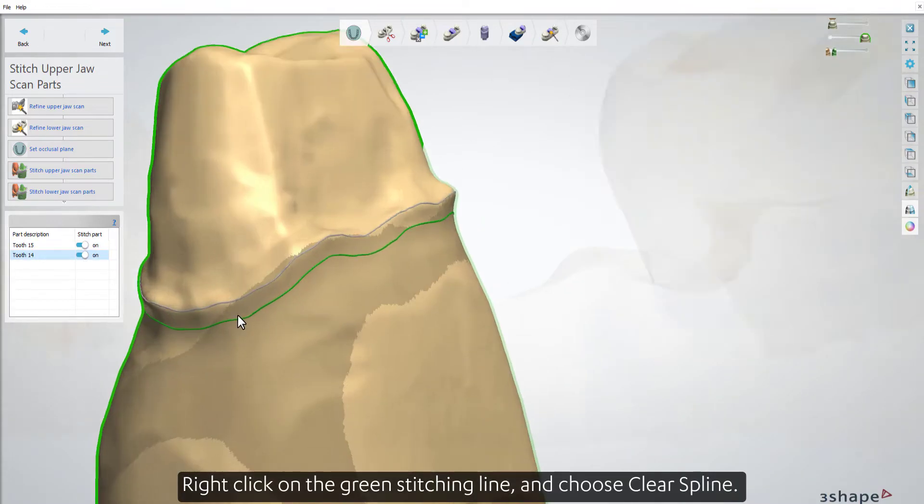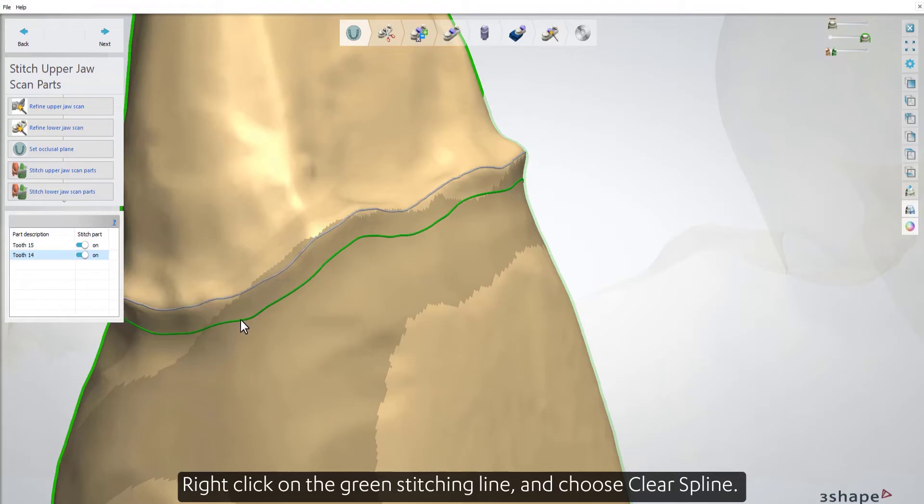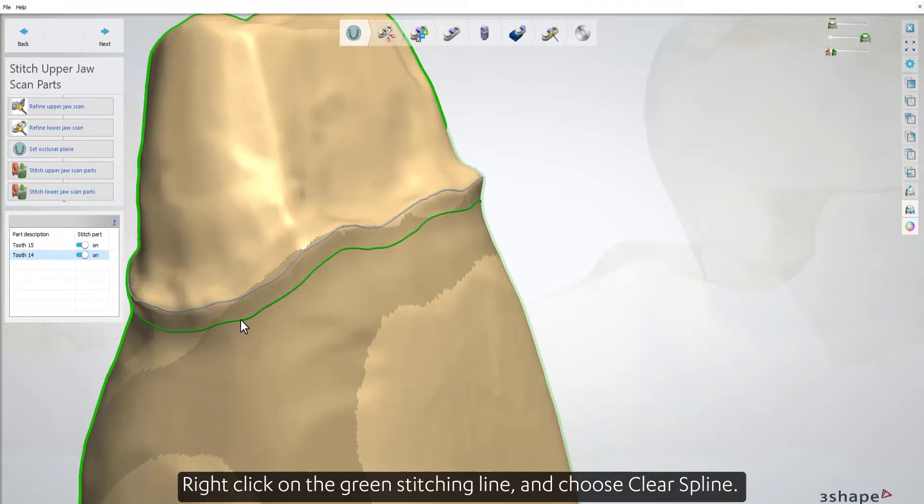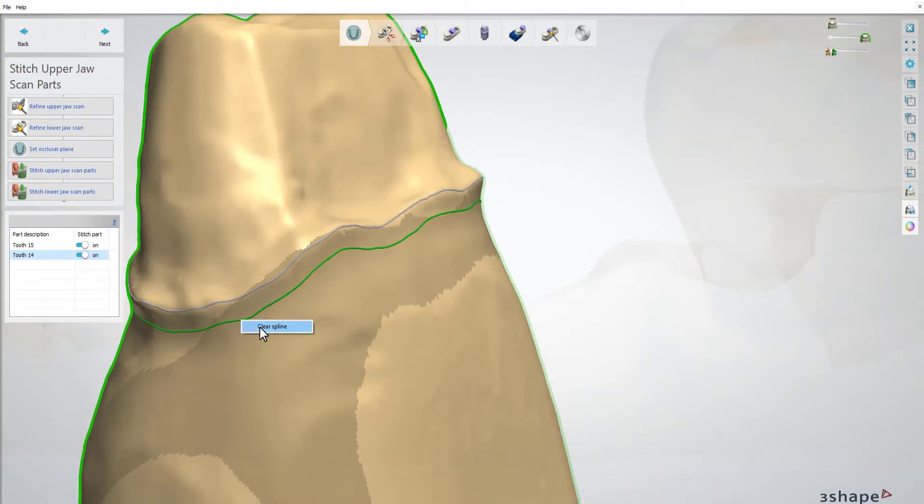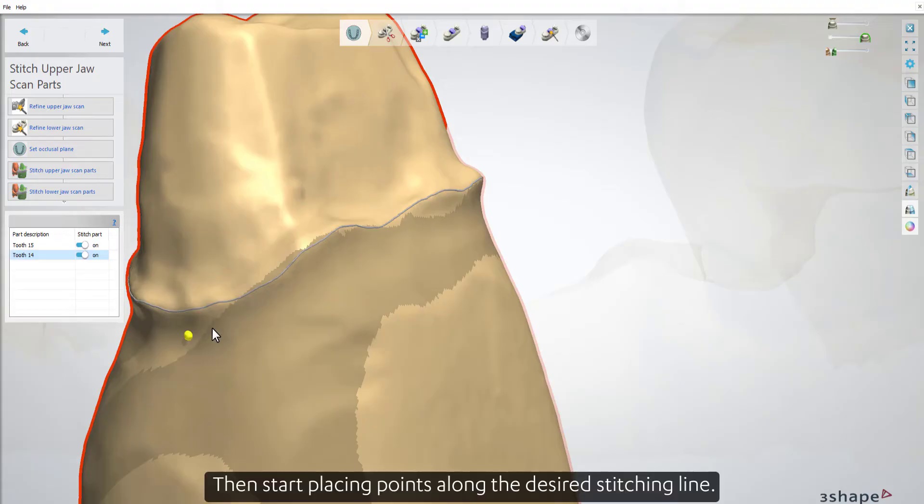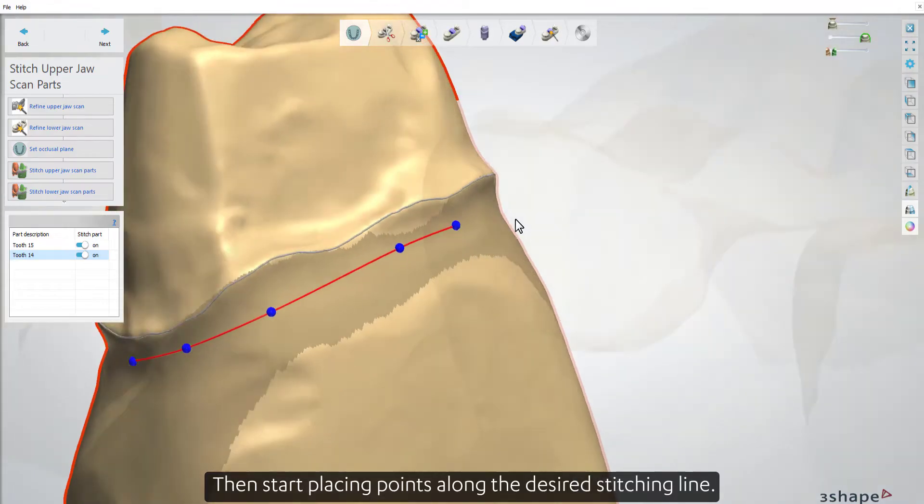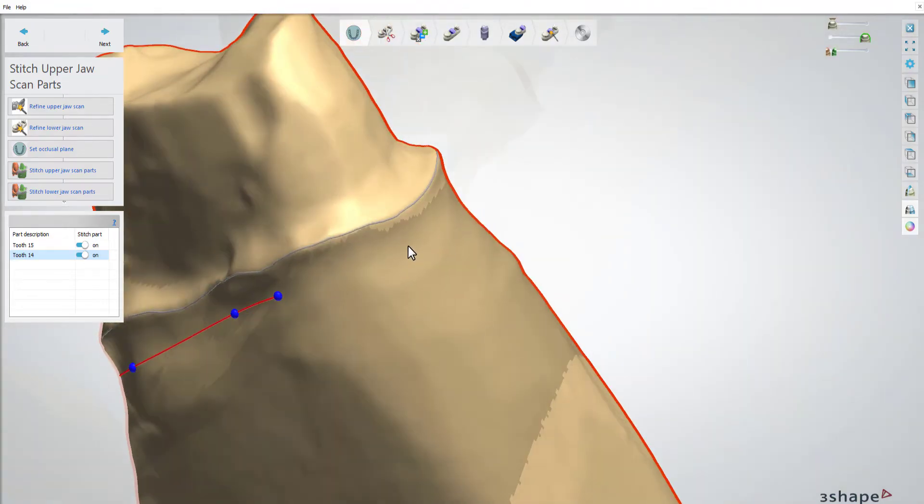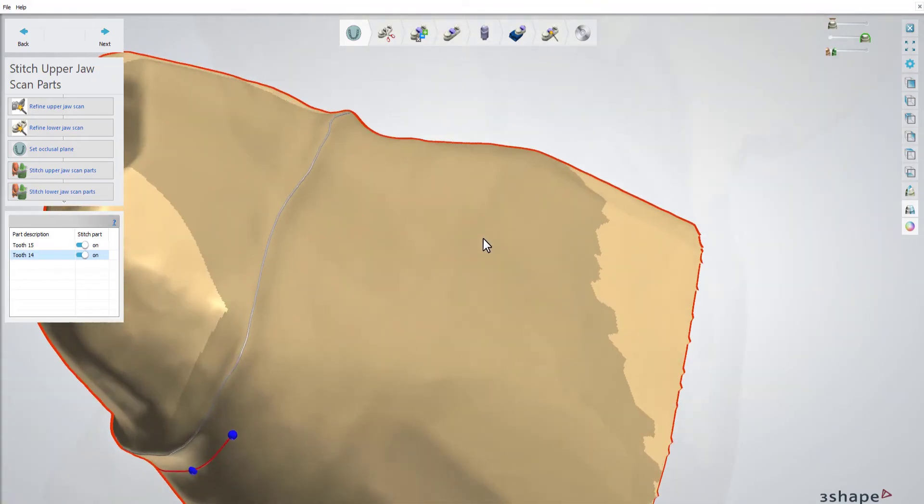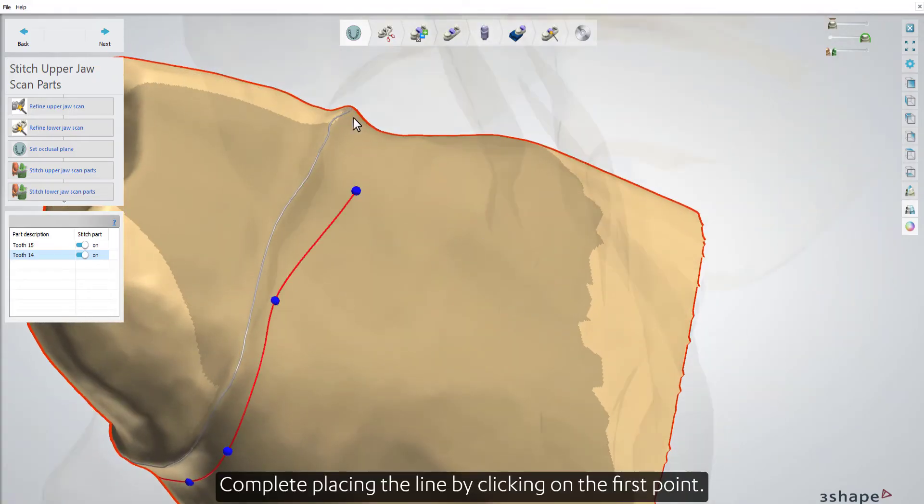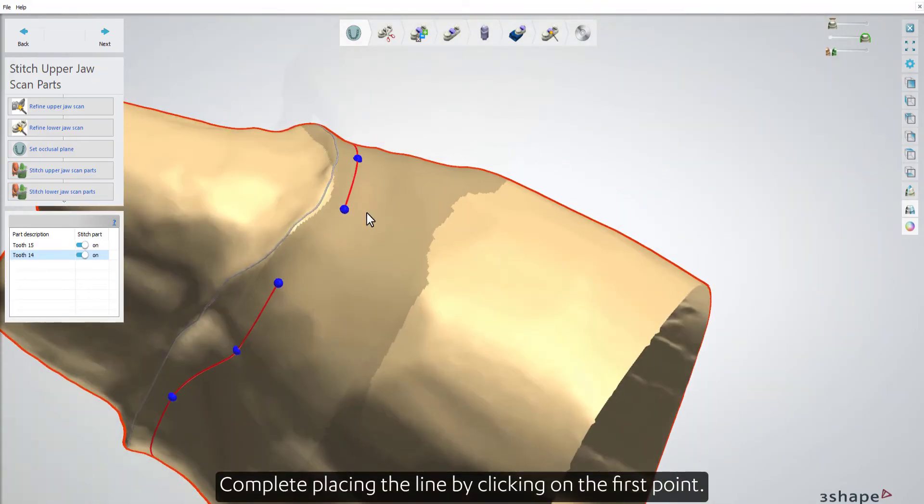Right-click on the green stitching line and choose Clear Spline. Then start placing points along the desired stitching line. Complete placing the line by clicking on the first point.